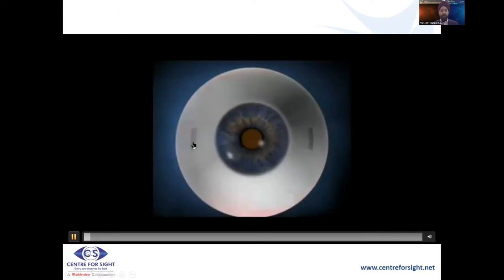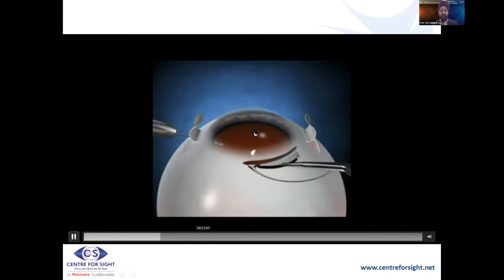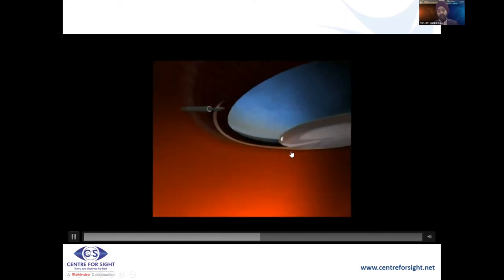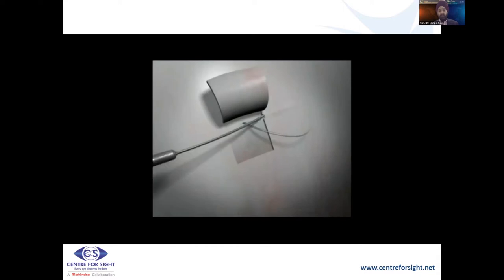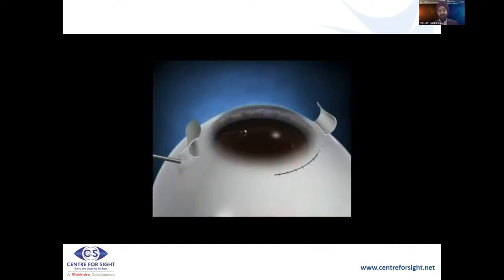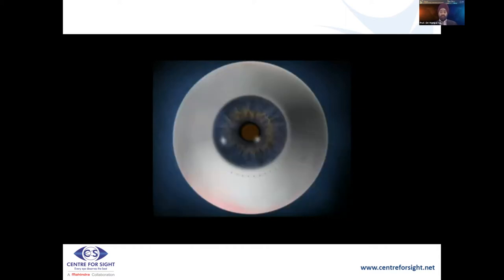But this complex prevents movement of the lens backwards, forwards, or sideways — that's what's very important. The scleral pocket is the most important thing for holding the intraocular lens. Schematically: make the flaps before entering the eye preferably, then the lens goes in with MST forceps and you pull it out. You can do a two-handed technique or a single-handed technique — go in with a needle, put in the haptic of the lens, then apply the two parts of glue. That completes the surgery.